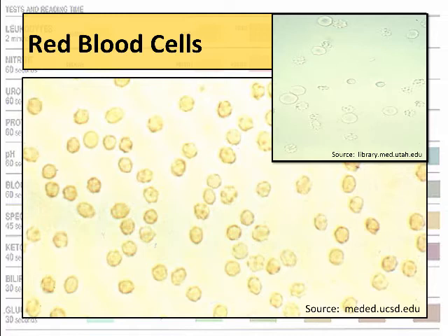What you're going to look for to identify a red blood cell is obviously the shape is relatively circular, and oftentimes they're going to look a little bit pink. And not always, sometimes they look clear, as you can see in the image up here, but they will give off a little bit of a pinkish hue because they are red blood cells. They have a lot of hemoglobin in them.